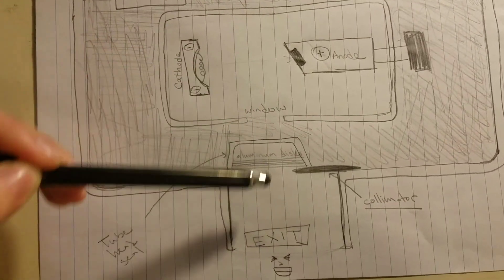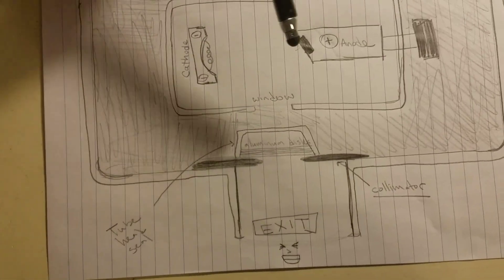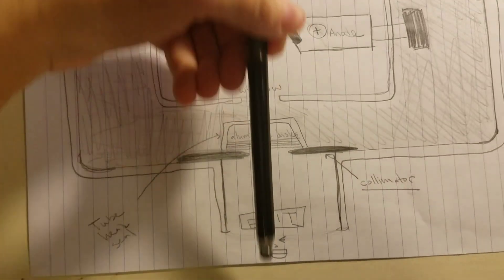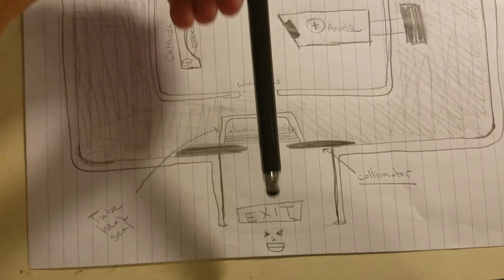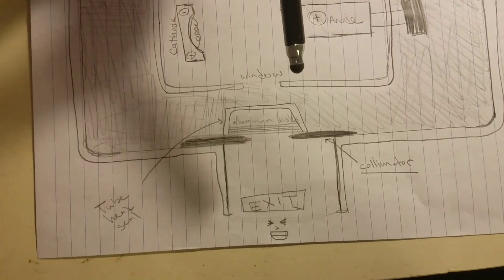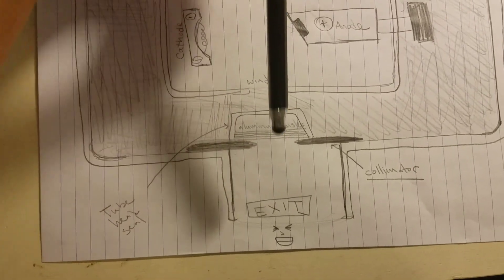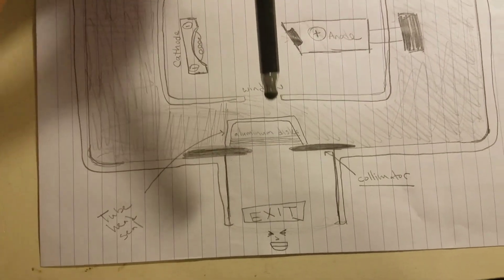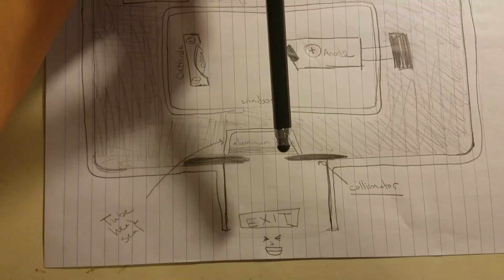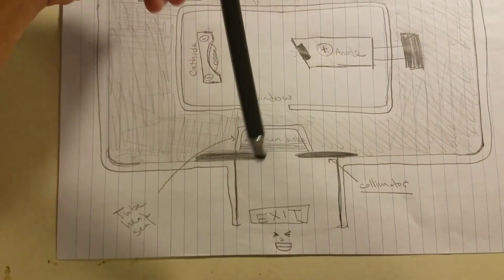This is the useful or the primary beam. So any beam that's going to go out, that's what's useful. So that's the primary beam, and it will go through the unleaded glass window, past the tube head seal, and through the aluminum disc filters.